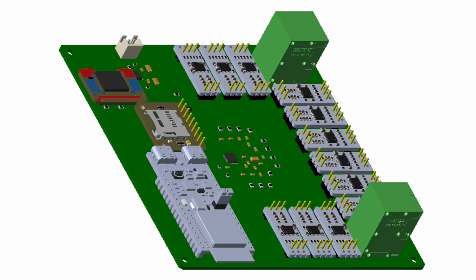The electrodes placed on the subject transmit biopotential signals to a custom-designed PCB for this project. The PCB shown is dedicated to the EEG system. Signal inputs are routed through labeled terminal blocks, with each terminal corresponding to a specific EEG or EMG channel. These low-amplitude signals are then amplified by individual bioamplifiers. There is one bioamplifier per channel to ensure sufficient amplification of the signal and proper differential for each signal.